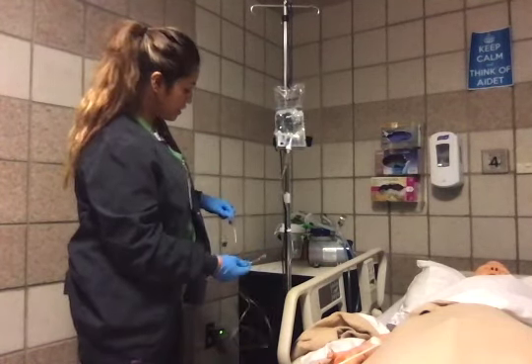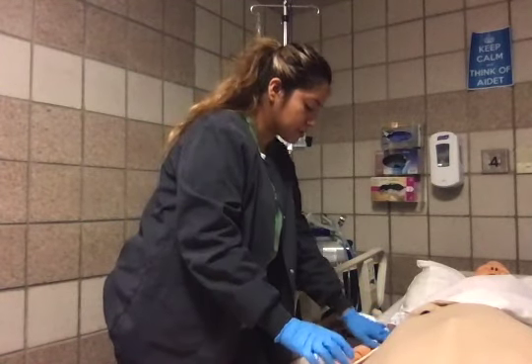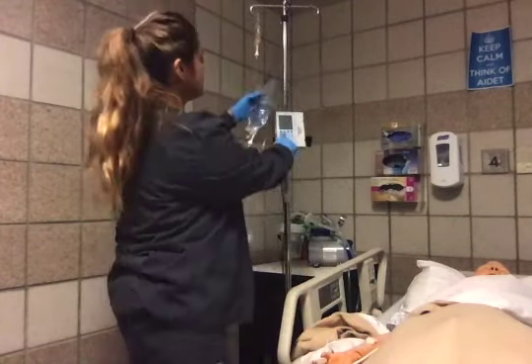And now we're going to look at our patient's IV site one more time, and we're going to make sure that it's patent. So we're going to grab our saline syringe and we're going to do the flush. And it's working just fine. Now I'm going to clean this port, and I'm going to clean my patient's port with a different alcohol wipe. I will connect it. And I will set my infusion rate and make sure that it is flowing.